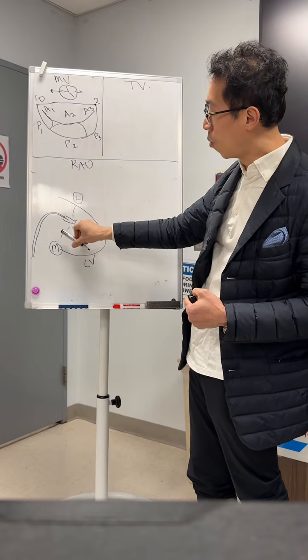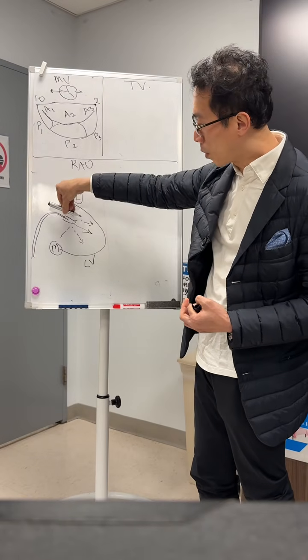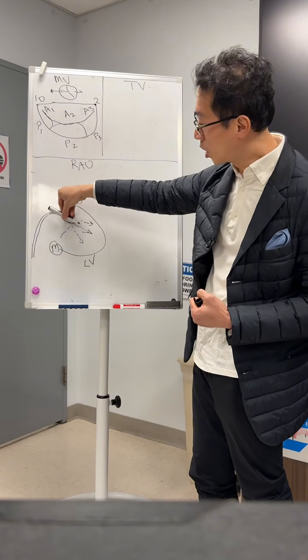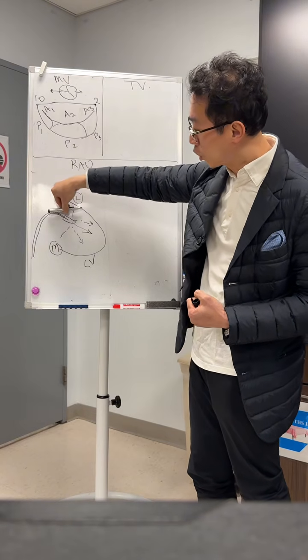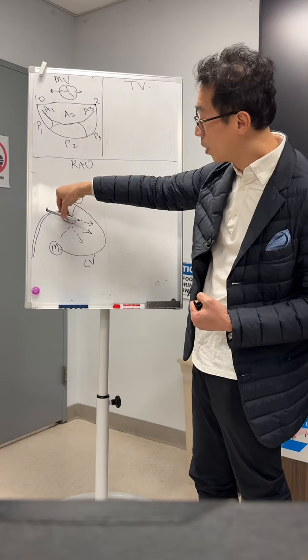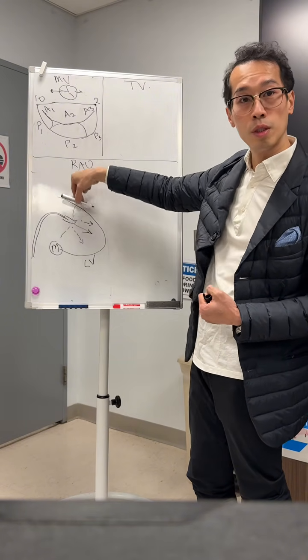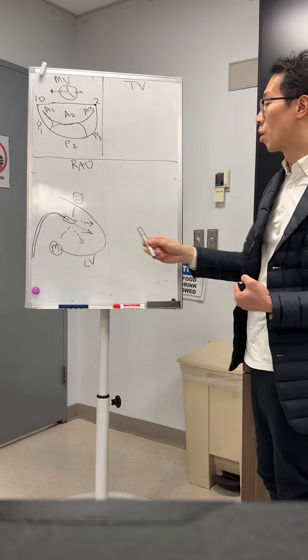So if you want to go more target on the medial side, there are two options you can do. If you're already perpendicular, you just withdraw the whole system, go medial. Advance the whole system, lateral. Now, if your trajectory is more lateral, you need to flex the M knob to go more central. If it's too much M, then you go less M. You don't need to advance or pull back. So that's a very important principle to look at on fluoro.